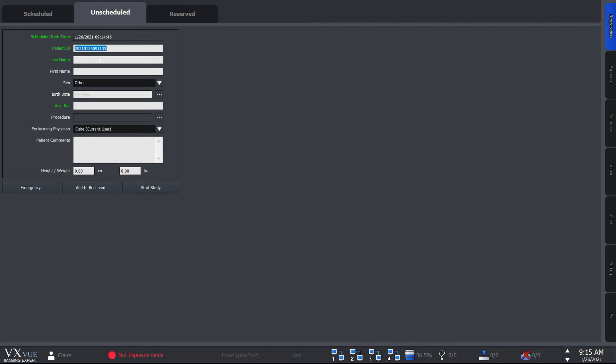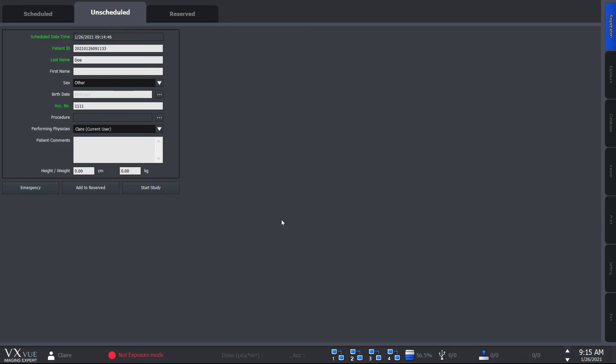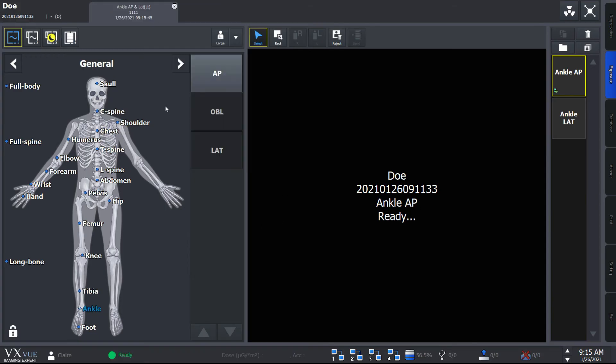Let's fill in the remaining required information. I'll type DOE as the last name and a session number. And you can also set the procedure by clicking this button. If you hit start study, it brings us to the exposure mode where you can take the x-ray images.